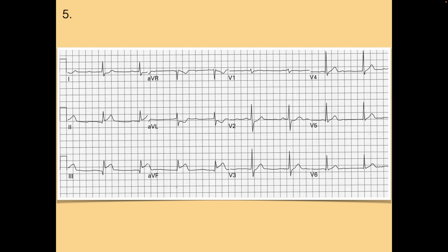Okay, who's next? Okay, Brandon. I didn't see anything on this one. So no elevation in the septal anterior leads. What does depression tell you though? We'll get there. Nothing right now, but it will soon. So Brandon is correct. There is not a septal anterior STEMI.